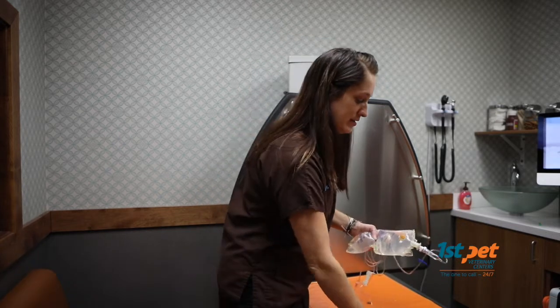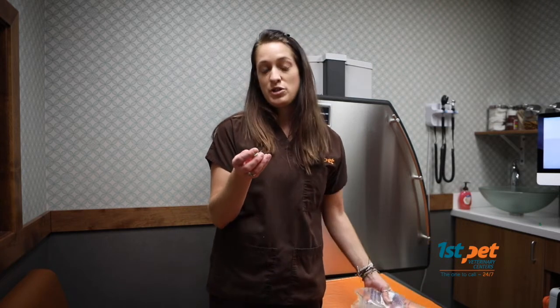It is important to remove the needle, and this should go in a sharps container, whether at your veterinarian's office or another means, but it should not go in your garbage.